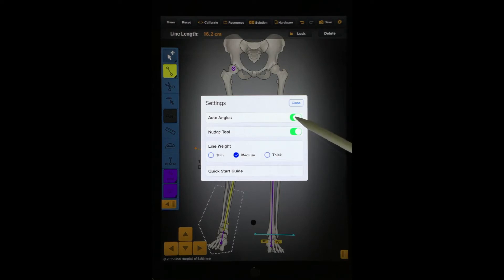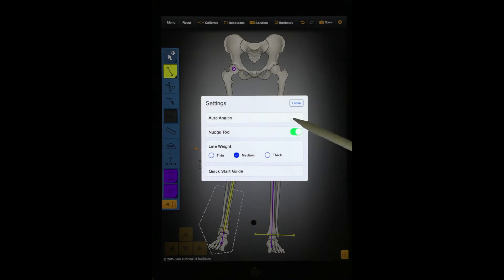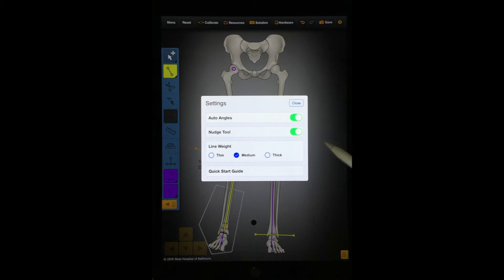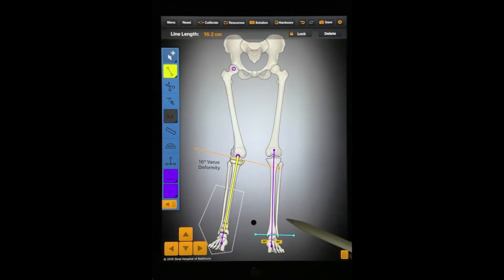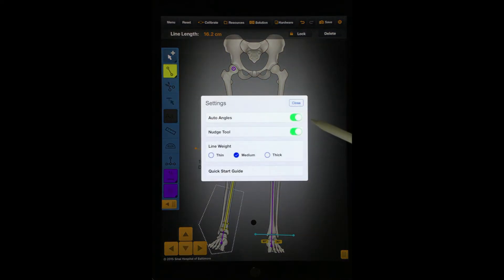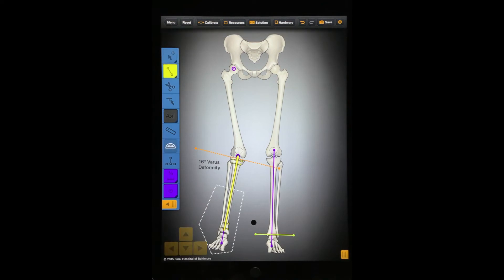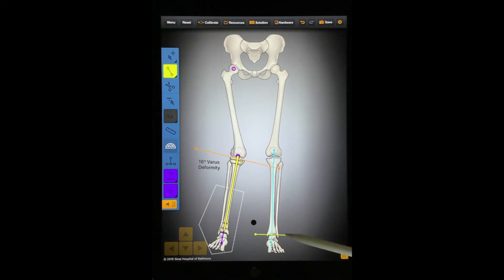Press this button to show or hide Auto-Angles. When Auto-Angles is on, it will automatically insert angle measurements after you draw intersecting lines. When the Auto-Angles tool is off, you can use the Protractor tool to measure the angle between two intersecting lines.